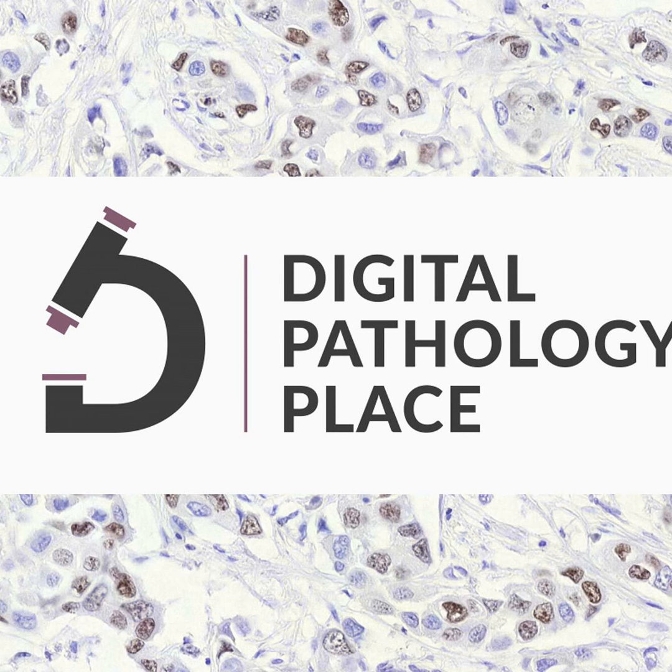So these are the ones that are going to pop up. In general, most foundation models were found to be susceptible to scanner bias, as shown by differences in embeddings and a drop in performance on the held-out scanner, the one the data was not scanned on. HistoLite offers low representation shift in embeddings. Yay! Lowest performance drop on out-of-domain data with modest classification accuracy.